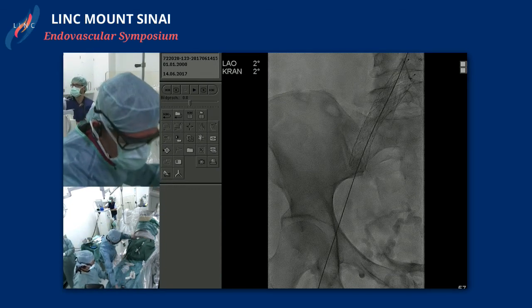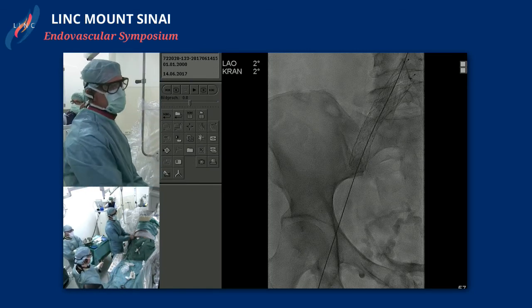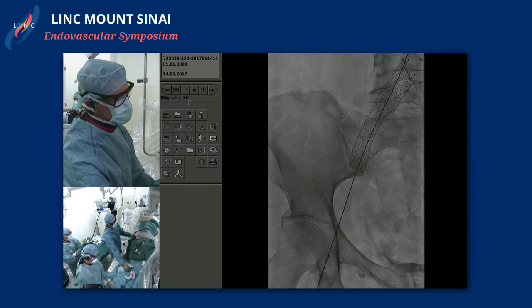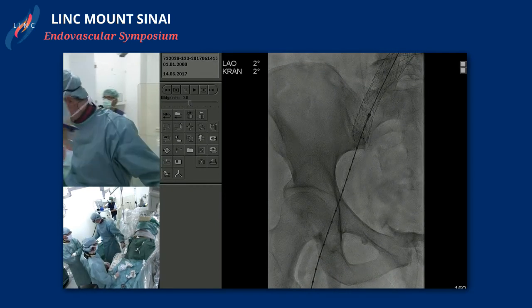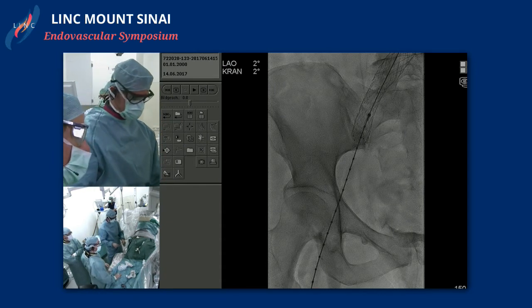For choosing here the right length of the next stent, I'm going to take in once again the IVUS catheter with the calibration markers on it, and this may be my overlap, and here with another venogram we can decide which length to use.